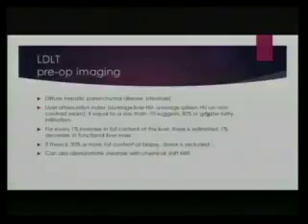Okay, so we talked about diffuse hepatic parenchymal disease, and we talked about how you can do the liver attenuation index. It's basically just taking the average of the spleen and the liver and subtracting the spleen from the liver. Did I say that right? Take the average of the liver, it should be higher than the spleen, subtract the spleen. If it's negative 10, then it's approximately 30% or greater fatty infiltration.